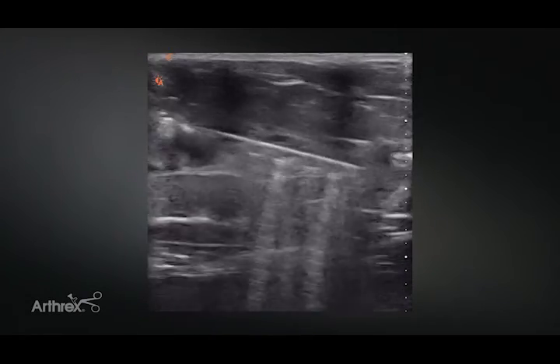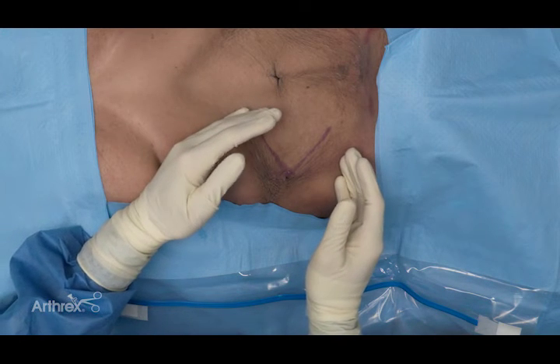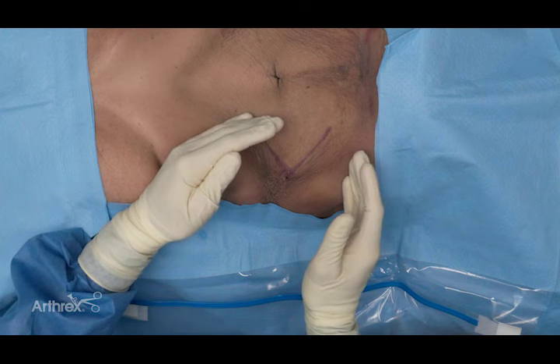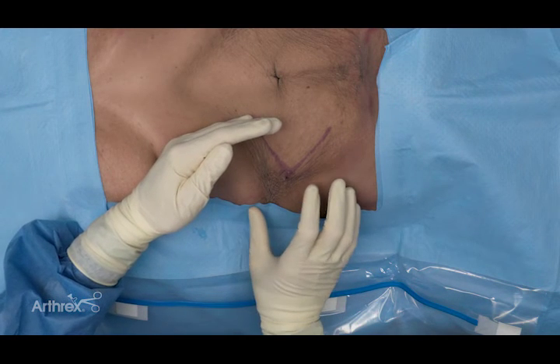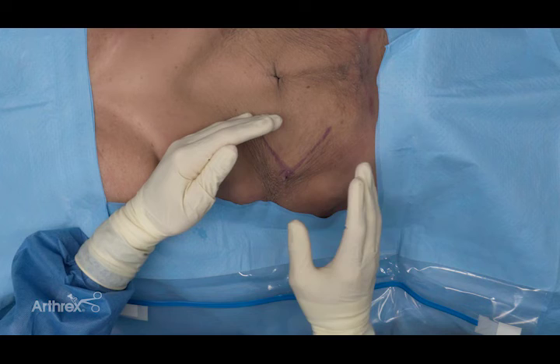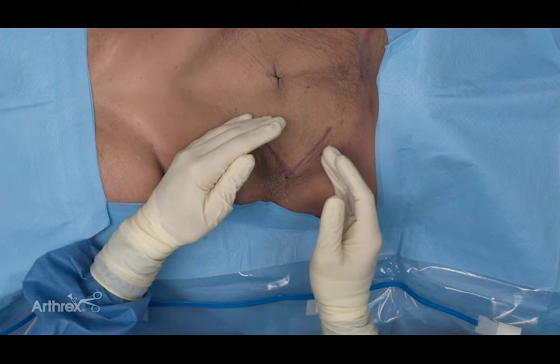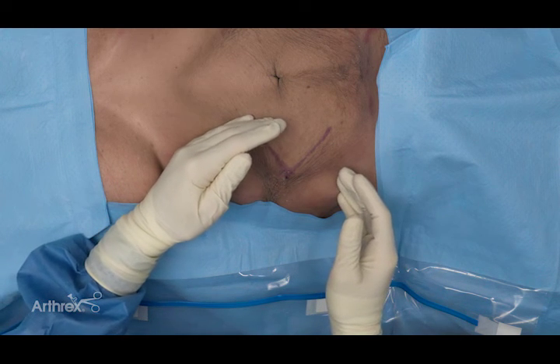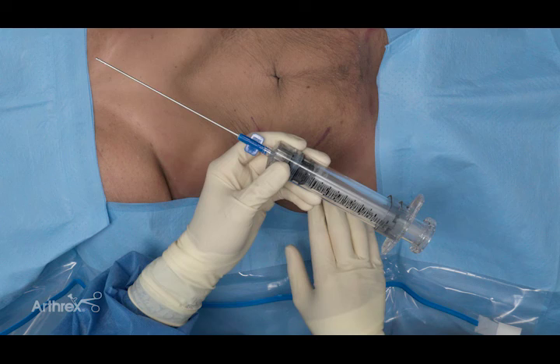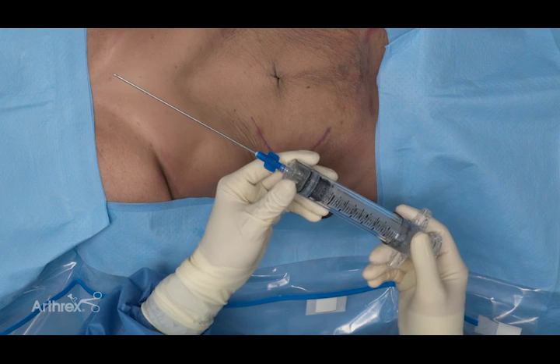Now we've administered all of our tumescent fluid. We're going to let that sit for about 15 to 20 minutes — certainly no shorter — to allow its full anesthetic and vasoconstrictive effect. Place some sterile gauze on the area since some of that fluid will leak out a little, which is normal and expected but good for patient comfort. Make sure a team member is always with the patient during this time. After 20 minutes, we'll be ready to begin our harvesting process with the Adipose Restore Syringe.